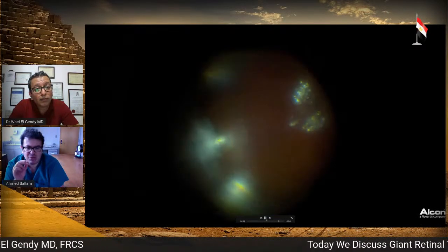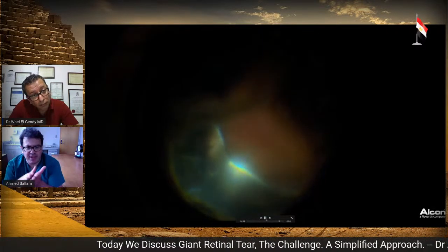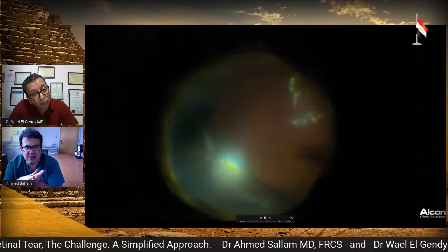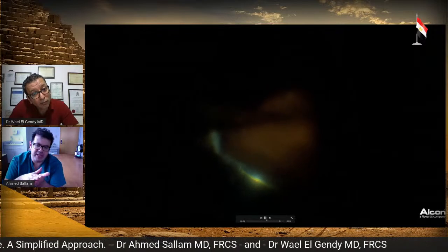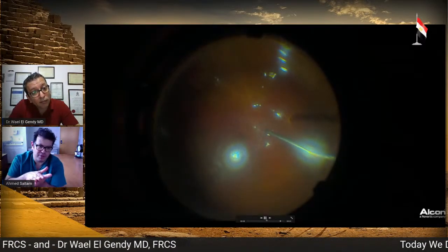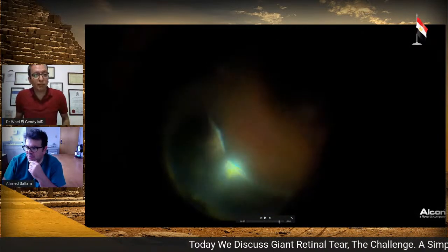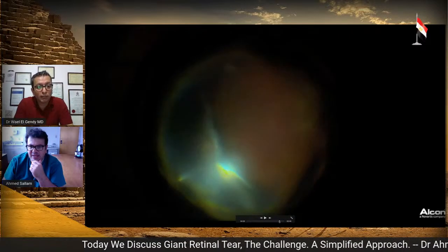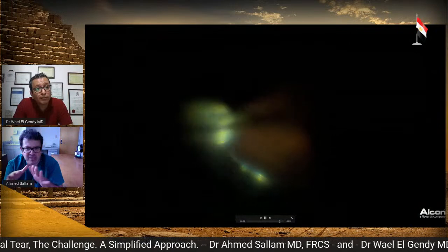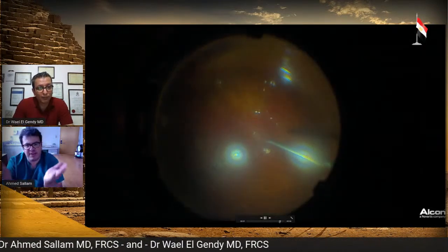And the trick really to know that, there are two tricks. One is that you find the edge of the tear while the air is coming in, and the air in the eye now is really on the RPE. Like you have a carpet, and now the carpet is really nice on the floor. That's one trick. The other trick is the bubble itself: you're now seeing the air separated from the PFCL, and you start seeing that the bubble of the PFCL is dispersing, or you're not seeing the convex surface anymore.